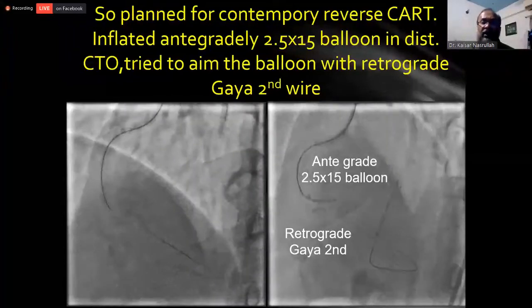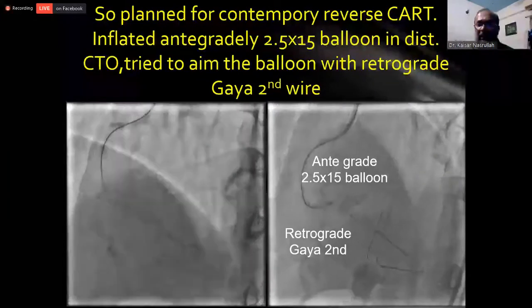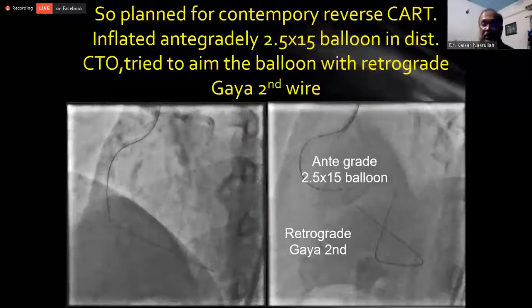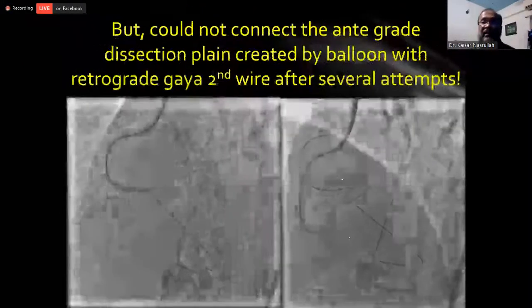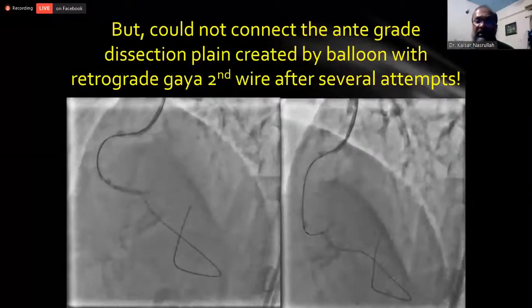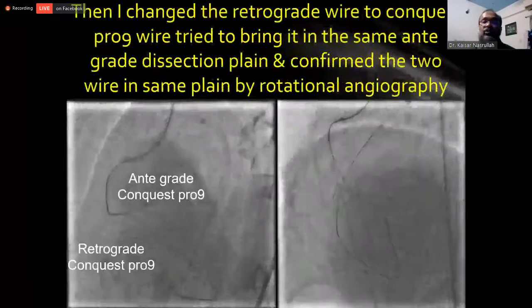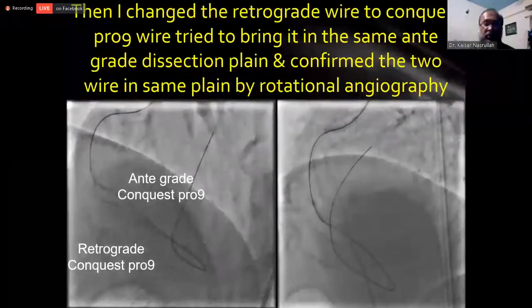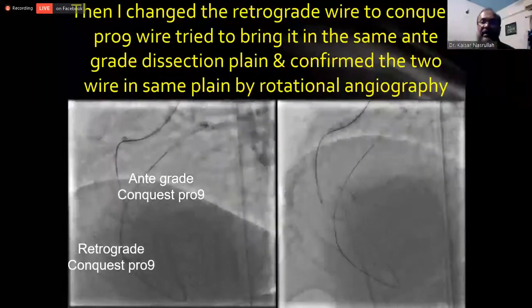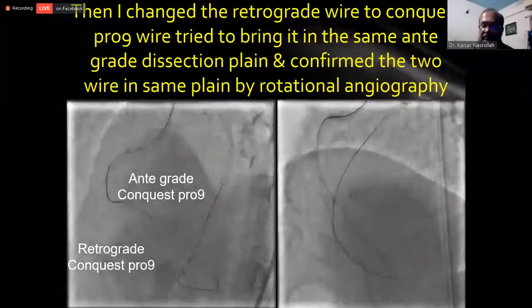Inflated an antegrade 2.5 by 15 balloon in the distal CTO and tried to aim the balloon with a retrograde Gaia Second wire, but could not connect the antegrade dissection plane created by the balloon with the retrograde Gaia Second wire after several attempts. Then I changed the retrograde wire to Conquest Pro 9 and tried to bring it into the same antegrade dissection plane and confirm the two were in the same plane by rotational angiography.